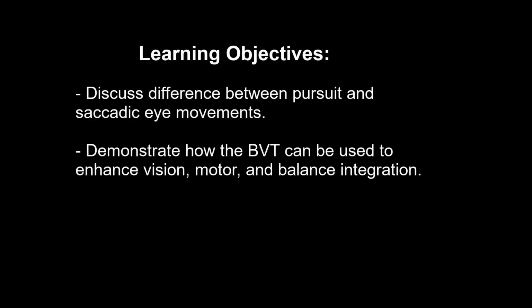Today I would like to cover two key points in this presentation. First, the difference between pursuit and saccadic eye movements. And secondly, how the BVT can be used to integrate vision, motor, and balance.